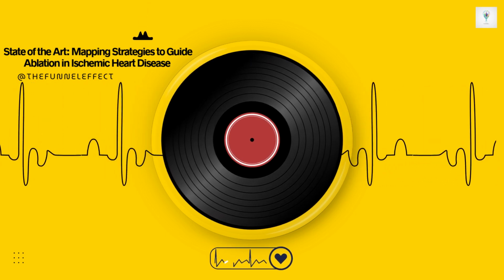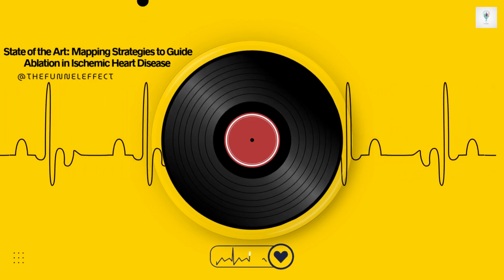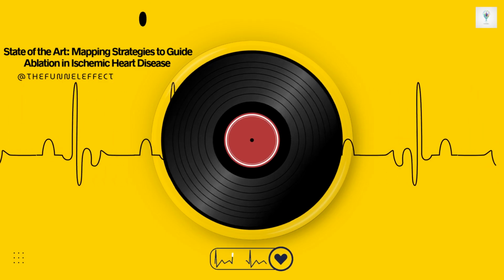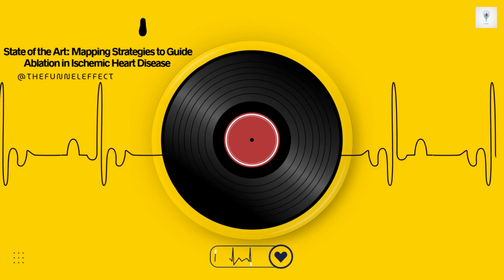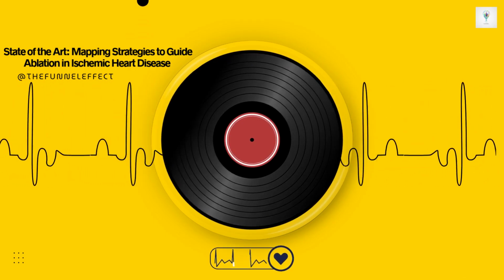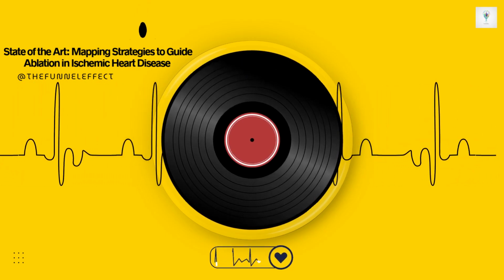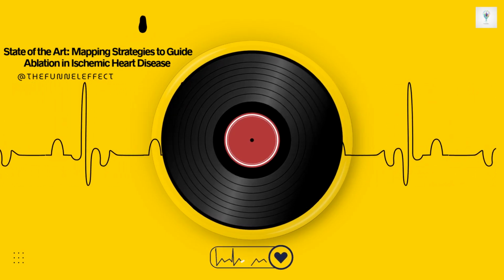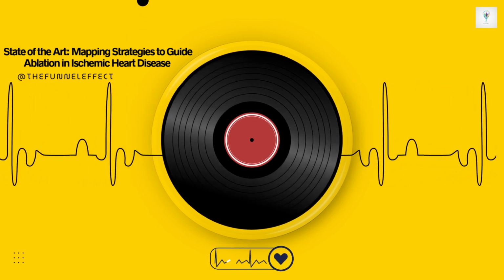Finally, let's talk about knowing you've hit the jackpot during the procedure. What are the signs, even before the ablation lesion is fully formed, that your catheter is right on the money, targeting the critical isthmus? There are three really strong positive signs described in the review that give you high confidence you're in the right spot. First is pacing termination. If during your entrainment pacing the VT suddenly stops, but importantly, it stops without you globally capturing the entire ventricle, meaning your pacing didn't just overwhelm the whole heart, that's a very good sign. It suggests your pacing disrupted the delicate balance within the critical circuit itself.